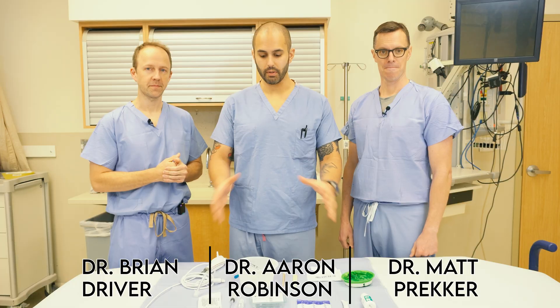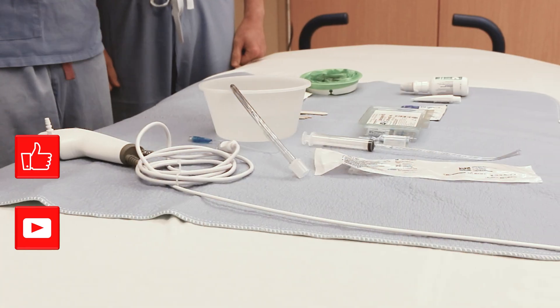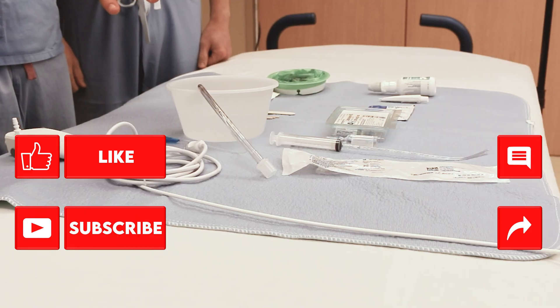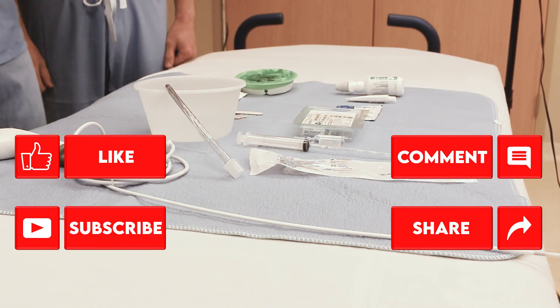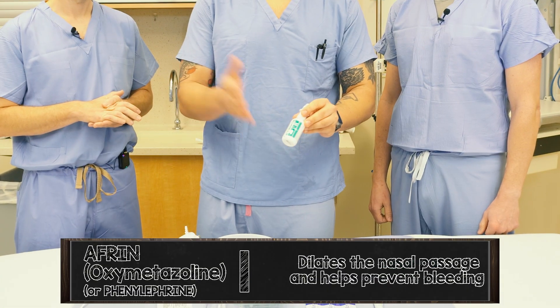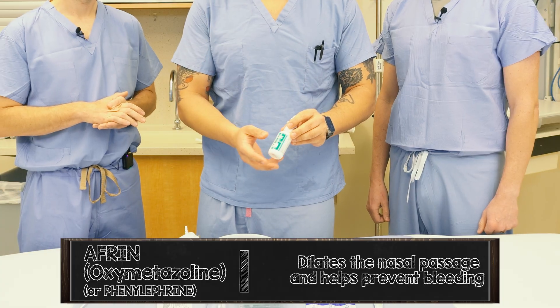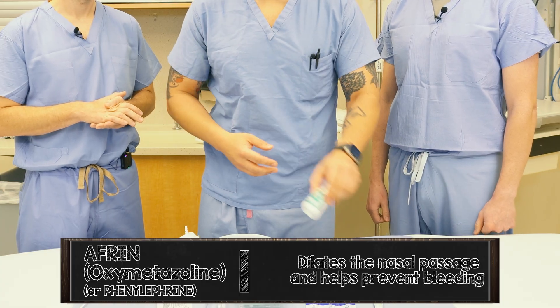We're going to talk about the various equipment you'll use when doing an awake nasal tracheal intubation. This is what we consider foundational for this procedure — everything has a very important role. First, you'll want some Afrin. You can also use phenylephrine — something for vasoconstriction in the nasal passage to help with secretions and bleeding.